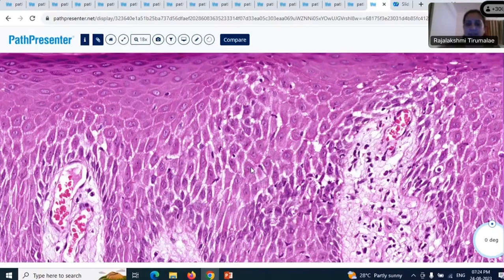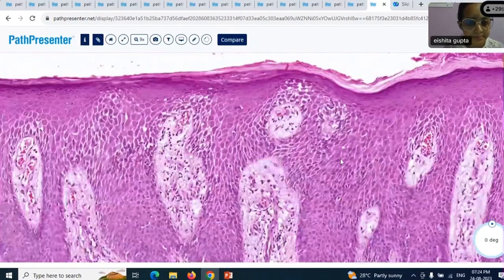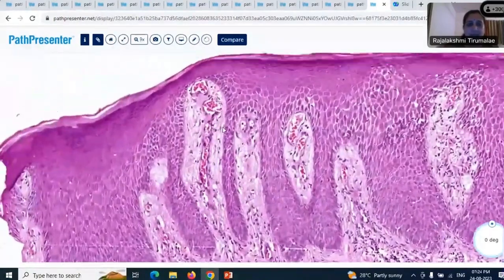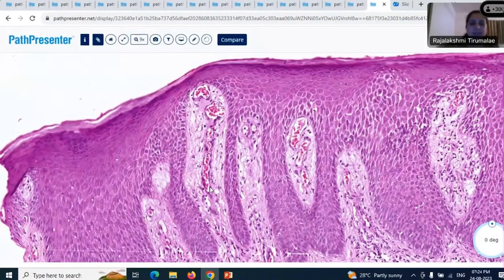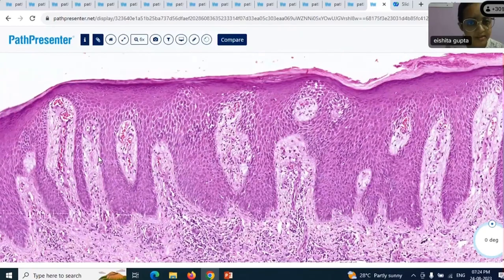And invariably when there is spongiosis, you will see inflammatory cells, usually lymphocytes. You're seeing a few lymphocytes here. And this is a little more advanced spongiosis. Now, coming to the dermis, as you rightly said, there are dilated tortuous capillaries, and some people call this the kissing sign. These are almost kissing the stratum corneum because there is suprapapillary thinning. Do you know what this corresponds to clinically? Auspitz sign. Yes, very good. So this corresponds to the Auspitz sign clinically.